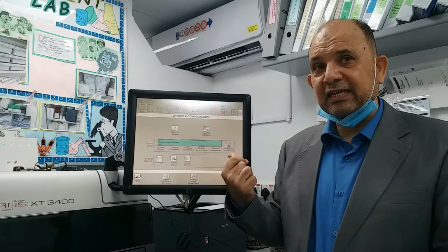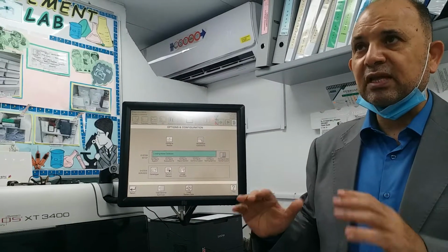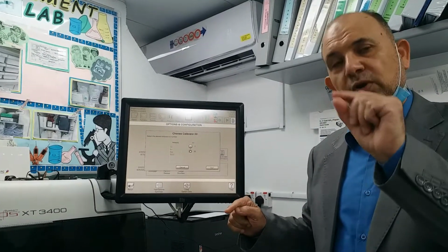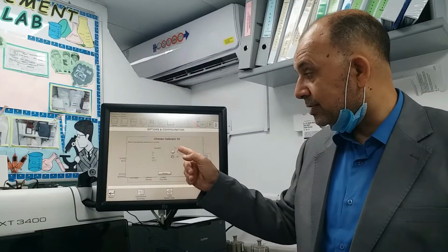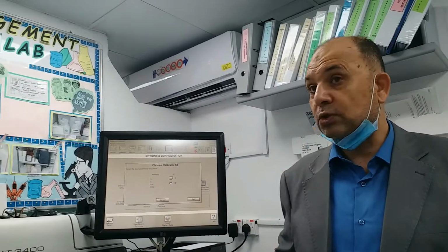Now it's loading the data from the downloaded data. It should come to some point and stop and ask me whether I want Cal 2 or Cal 32. In this one I have to decide either Cal 2 or Cal 32. Now it's asking me whether I would like to run Cal 2 or Cal 32, because this is an alternative option now. It's a new option in the system. Before, it was not.